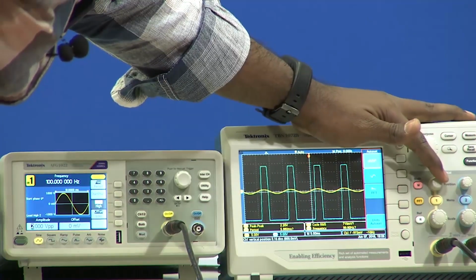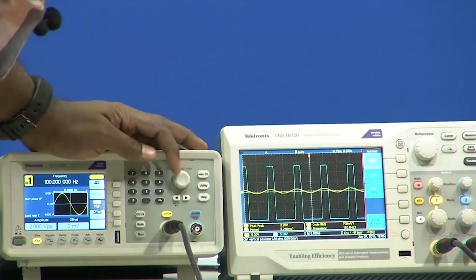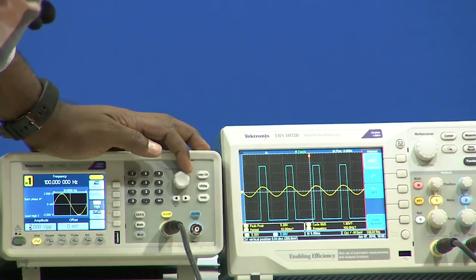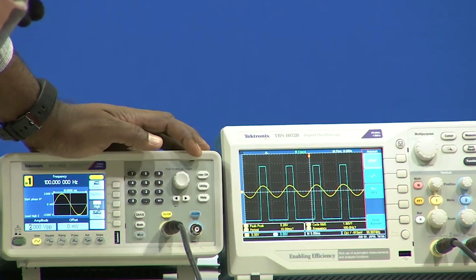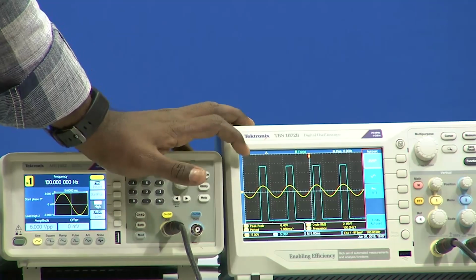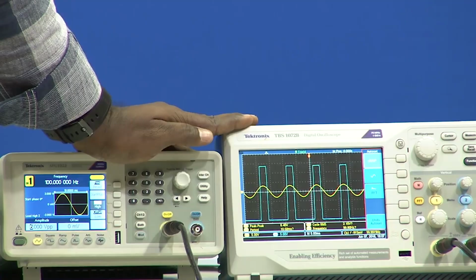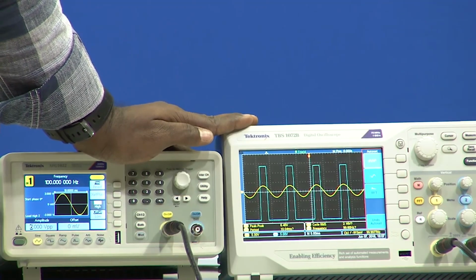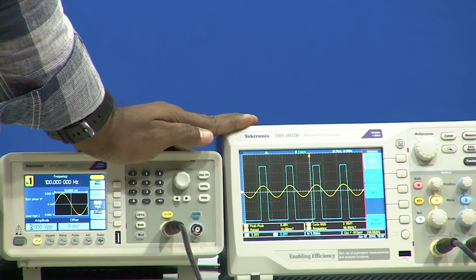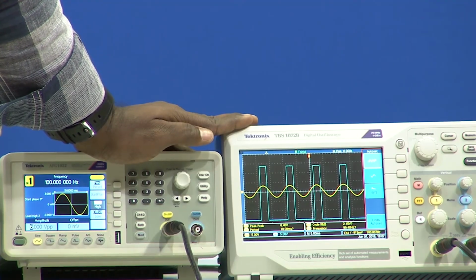Since it is difficult to understand, what I will do is change the input amplitude itself to somewhere around 6 volts peak to peak. So, that means 3 volts. So, here it is clear. Now, if you remember the threshold, the theoretical threshold for 3 volts would be 666 millivolt into 3, but practically we are getting 1.2 volts, right. So, practically we are getting somewhere around 1.2.